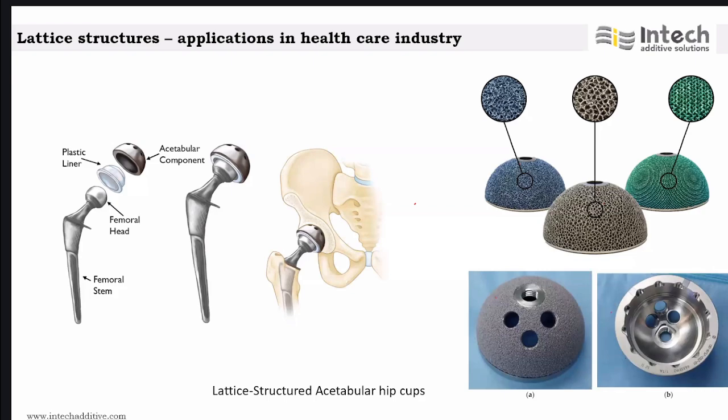It is available here. In the implant, you can see that the number 12 means a rough side, which is highly porous, and the classification involves the lattice. That means you have to go see whether the surface helps to grip the bone by press fit, and it is actually there.